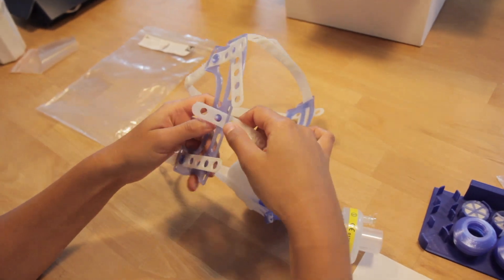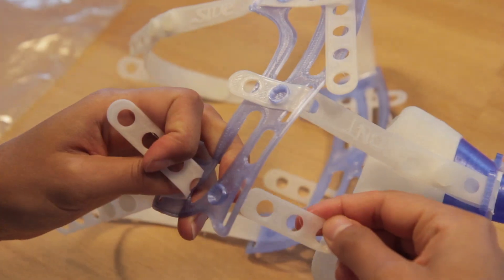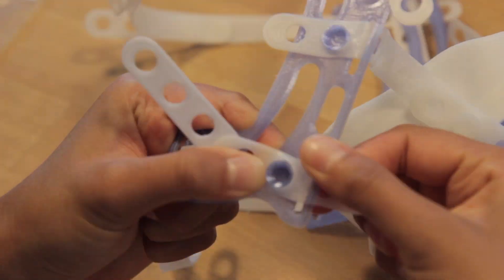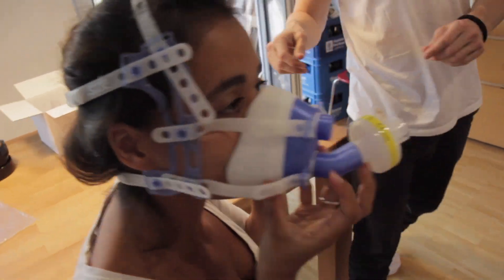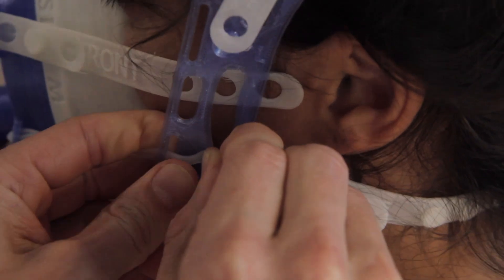Connect one side of the front part of the mask with the head mount on the top and the bottom latch. Now you can take the whole assembly and fix it to the patient's head. Secure the mask by threading the front two straps to the head mount.